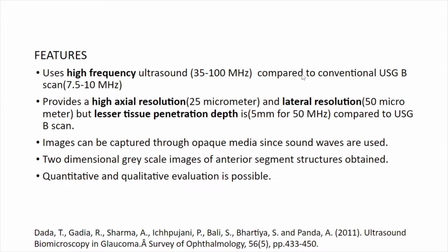The advantage is that images can be captured even through opaque media since we are using sound waves. We will be generating two-dimensional grayscale images of all the anterior segment structures. And one more advantage is that quantitative and qualitative evaluation both are possible.